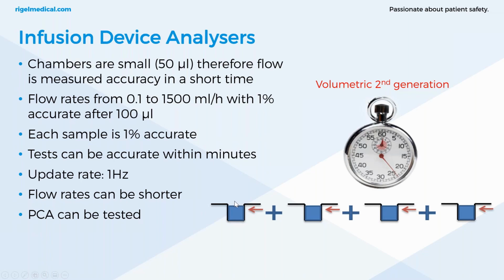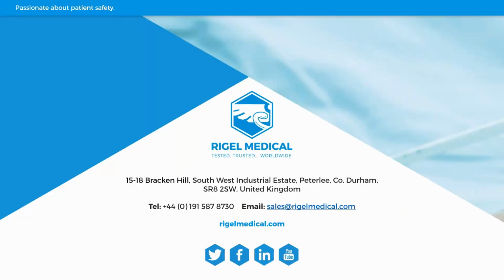One thing to note, if you are using the multi-flow, is that the bolus must be at least 5 times greater than the basal flow rate testing. It also does accurate and fast measurements of flow pressures. So we're talking about the 50 microliters, as well as providing a back pressure simulation for any occlusion tests.